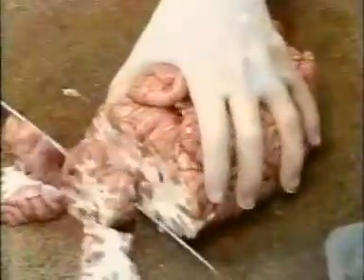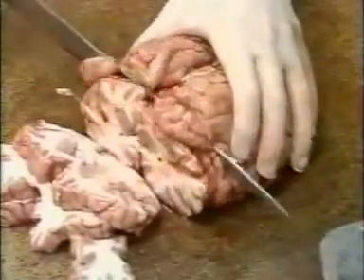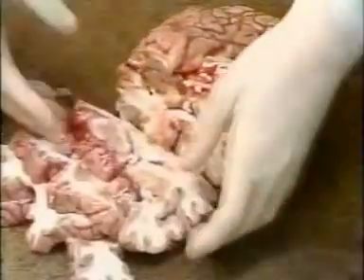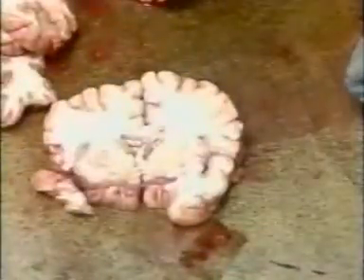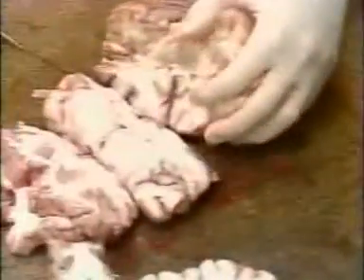Now what she'll do is just serially section through the brain. That division between white and gray is more apparent here in the cerebral cortex. You can see fluid leaking from the ventricular system. The white band crossing from the right and left sides is the corpus callosum. Essentially, that's how the two halves of your brain communicate with each other.